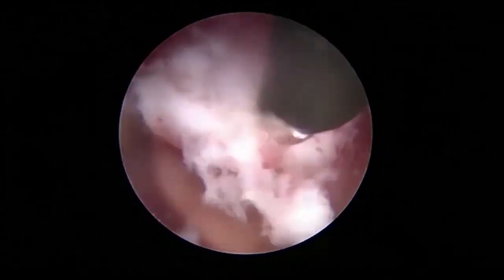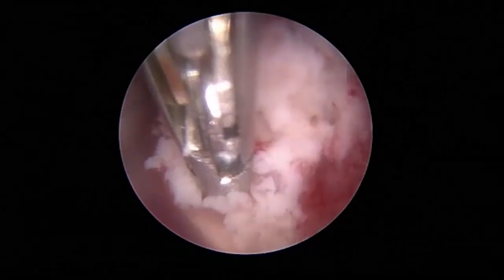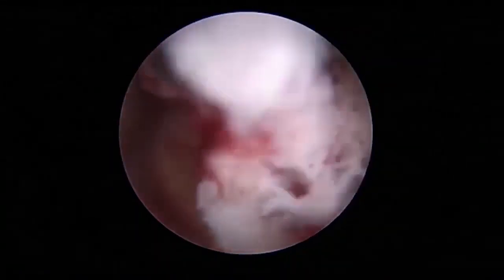Here we're using the forceps once again to remove portions of the tumor, which are sent to pathology and to tumor bank. You can begin to see the normal intraventricular anatomy with the septal vein deep to the resection cavity. All of the bleeding is dealt with by continuous irrigation, which washes out of the head. Here we are bipolaring once again.